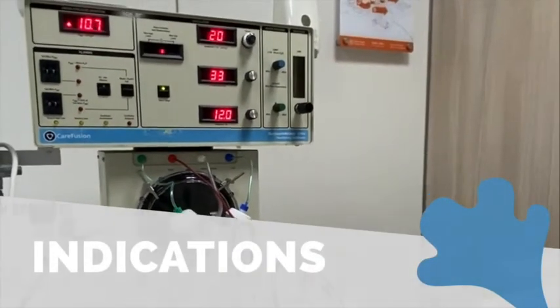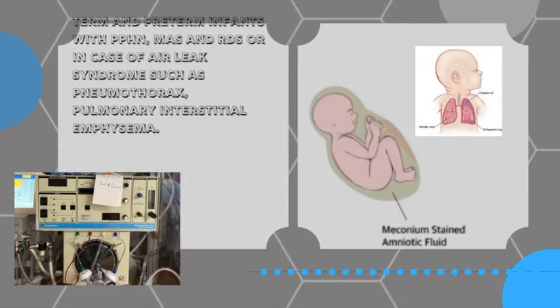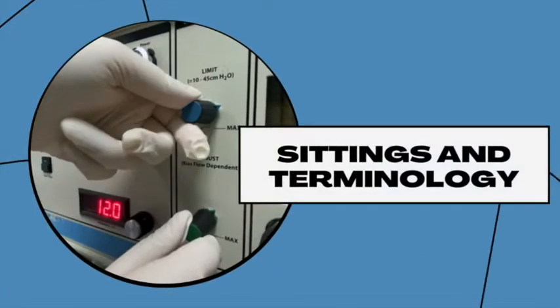Okay, but what are the indications for using high frequency oscillatory ventilation? High frequency oscillatory ventilation is often utilized as a rescue strategy when conventional mechanical ventilation has failed in term and preterm infants with PPHN, MAS, and RDS, or in a case of air leak syndrome such as pneumothorax, pulmonary interstitial emphysema. What are the settings in high frequency oscillatory ventilation and how to set them correctly?